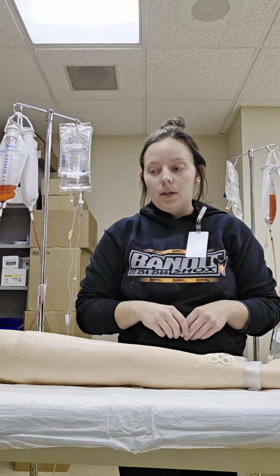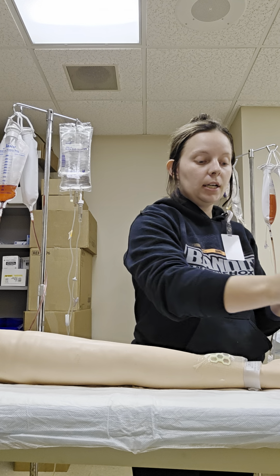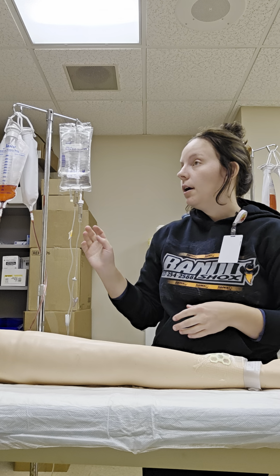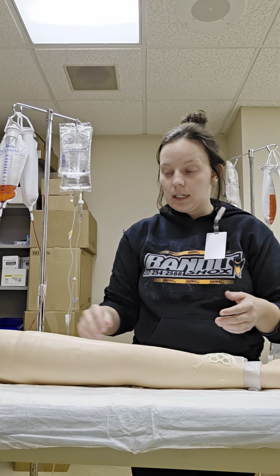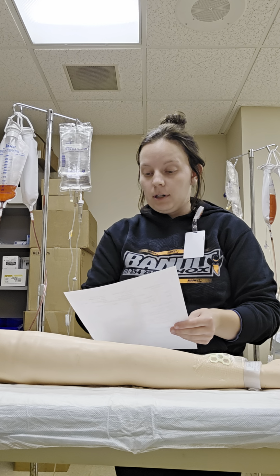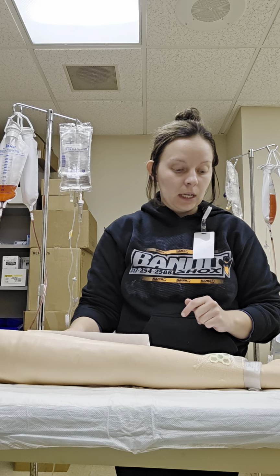Okay, so entering my patient's room, providing privacy, performing hand hygiene. Good evening, Mr. Foley. My name is Samantha. I'm going to be administering your IV piggyback today. Can you please tell me your name and date of birth? Ferdinand Foley, 9/23/69. Matches his bracelet, matches my MAR.